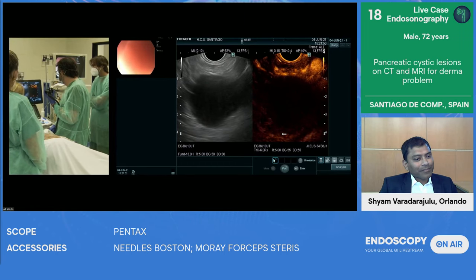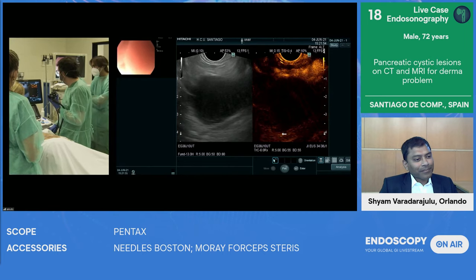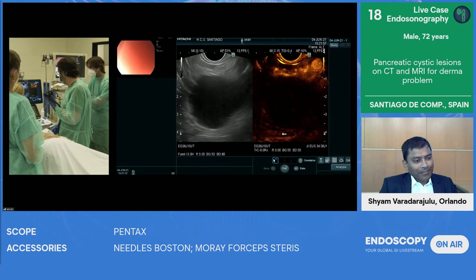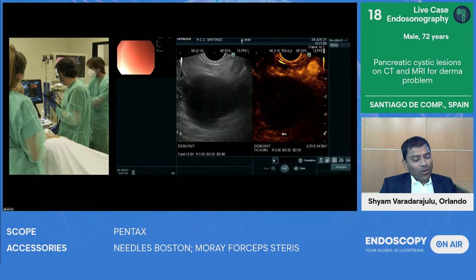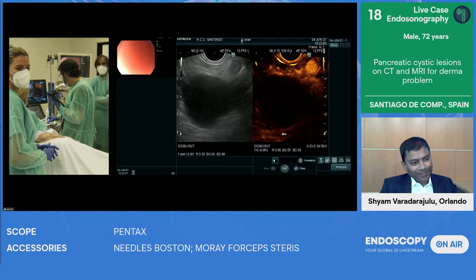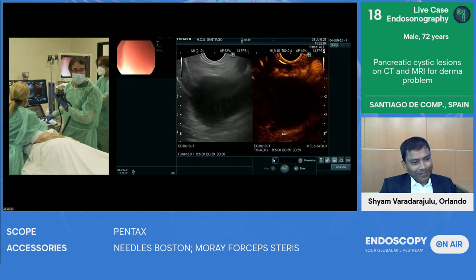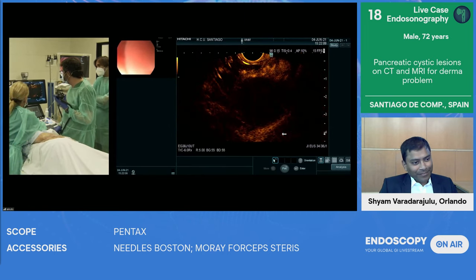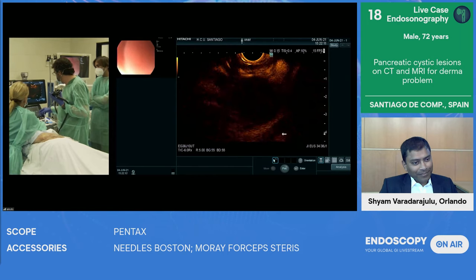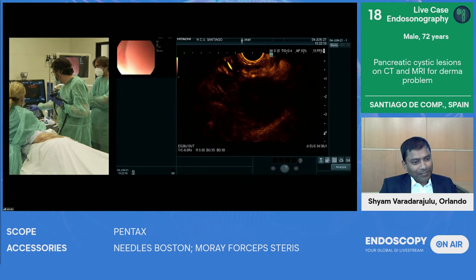But this is one of the things, another tool that you have in your hands in order to evaluate these lesions. So you will just now aspirate this with a 19-gauge needle, I presume? Yes, we will try. Because even if it's a mucinous lesion, sometimes when we want to make an access with the 22 or the 25, it is a little bit difficult to obtain a good sample.